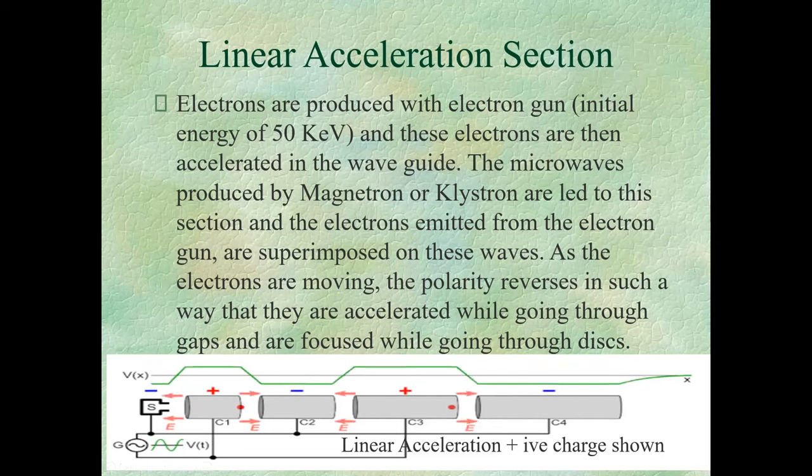And that is because when the ion chamber was going out, when the oxygen was getting depleted inside it, there was an upward trend, and you were adjusting your output of the machine every 2 or 3 months. The machine would show a higher output, you would bring it down. The next month or 3 months later, the machine would again show a higher output, 1 or 2 or 3%, and you would bring it down. So that upward trend, then suddenly when you change it, now you have a new ion chamber, and you have a 15 to 20% lower output. Your output can be at 85% or 80%.